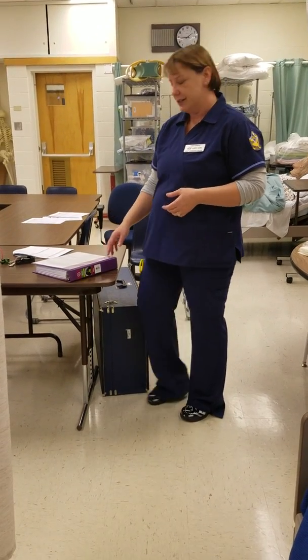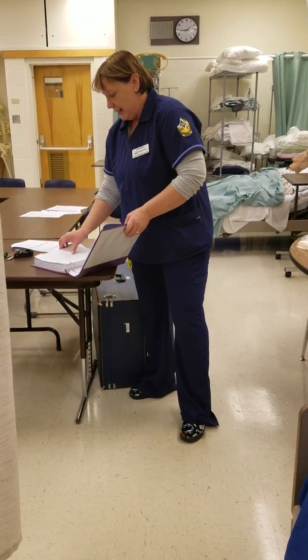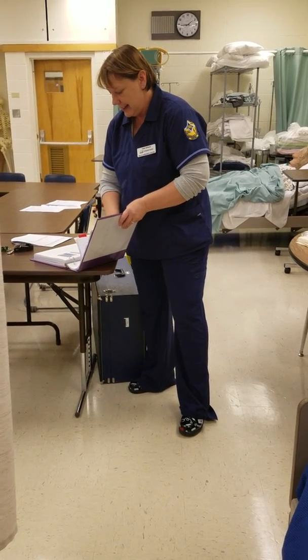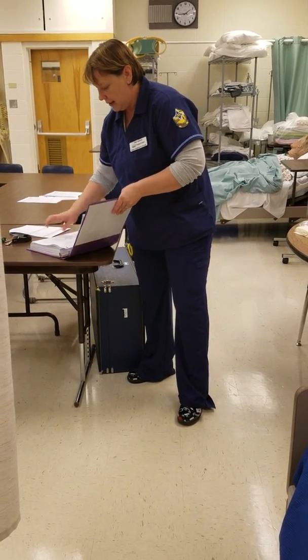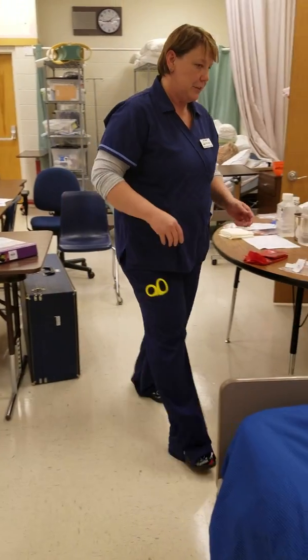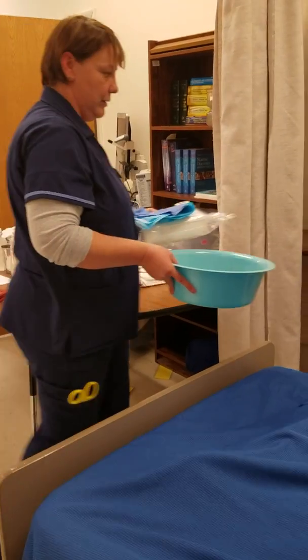Today I'm going to do an instructional video on how to insert a dwelling catheter in a male. The first thing I'm going to do is check the patient's chart and make sure that this is something the doctor is still ordering — and it looks like he is. So once I have verified that the catheter is still needed, I need to go ahead and gather my supplies and head into the room.